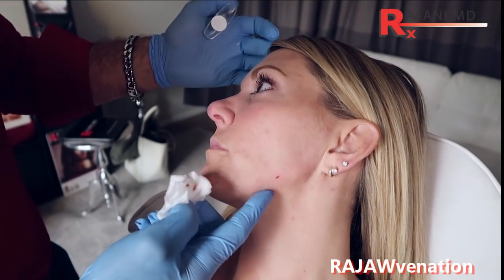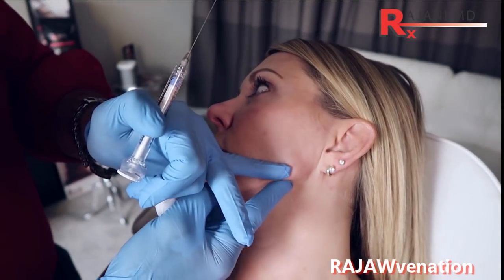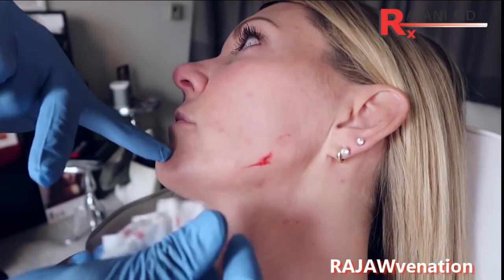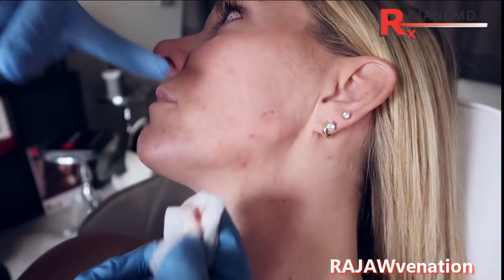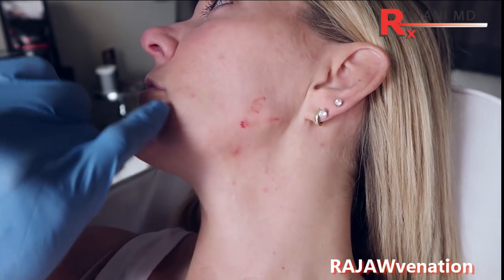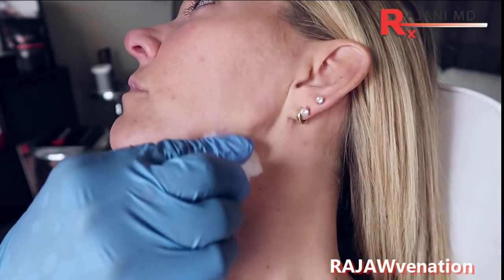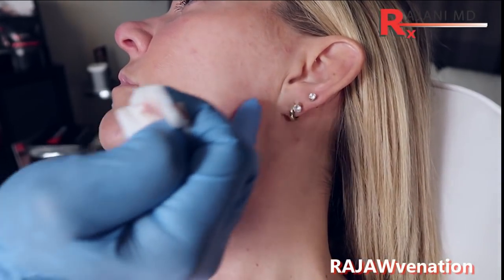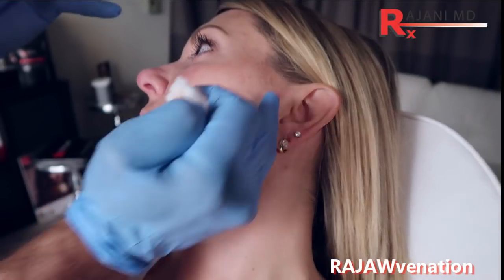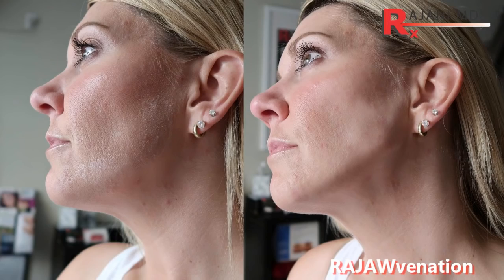Now you could mold that if you wanted to and create a defined jaw. If someone wanted an even stronger jaw, you could go along the whole length here — creating the jawline posteriorly to pull up from the edge of the oral commissure to create a nice, slightly more squared look, in keeping with a triangular aesthetic. We don't want to fill it too much and square the patient's look. So that's the patient's one side — we will now go and fill the other side to complete the treatment.